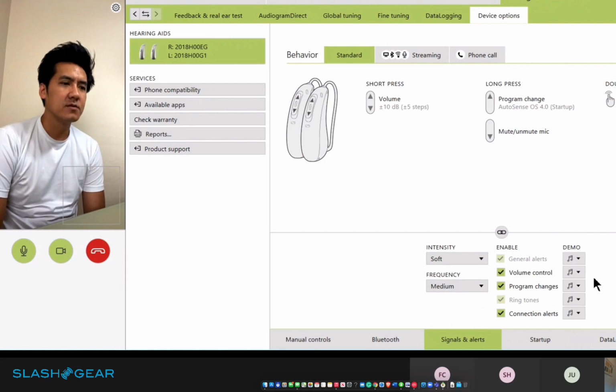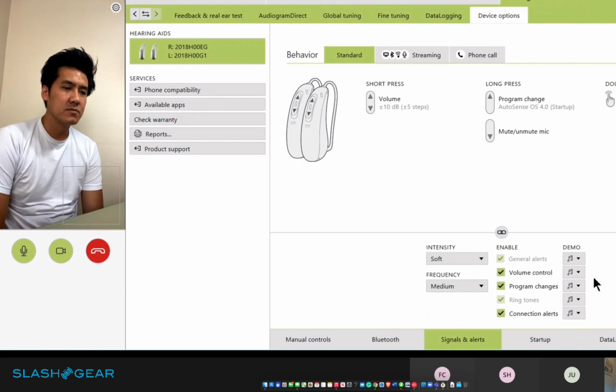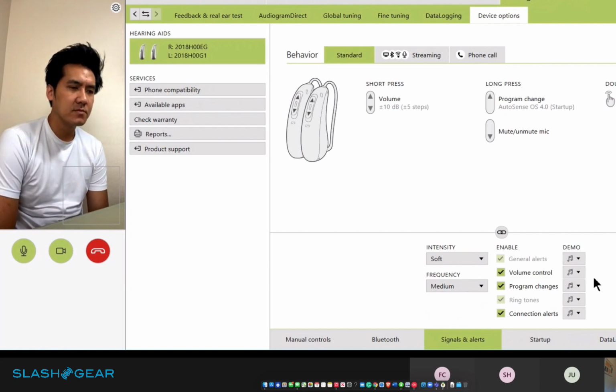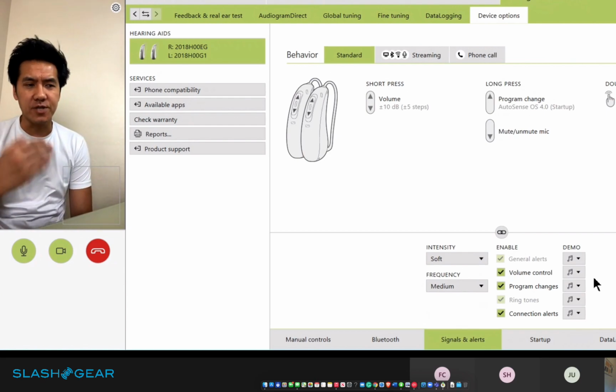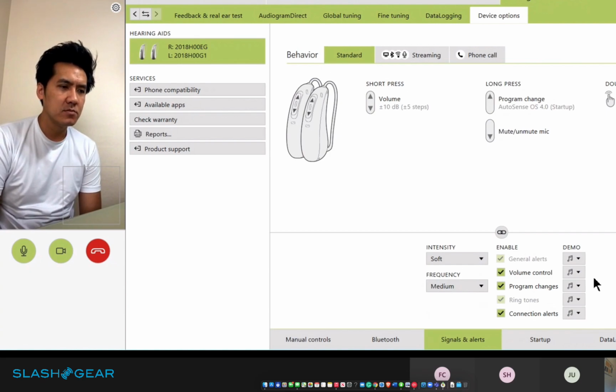Okay. So a common example would be a physical loss of the hearing aid. For example, if you're just changing a shirt, it happens, the hearing aid gets caught in it and then it comes off. And for older clients, they may not recognize that it fell off. And so then they start to walk away and then they get this alert, hey, my partner's missing. How long does that alert go for, or does it constantly chime in? Just one time. Yeah, because constant could be quite annoying.